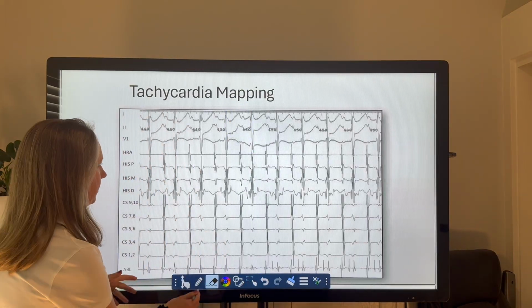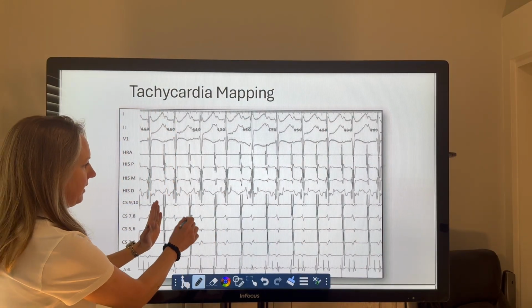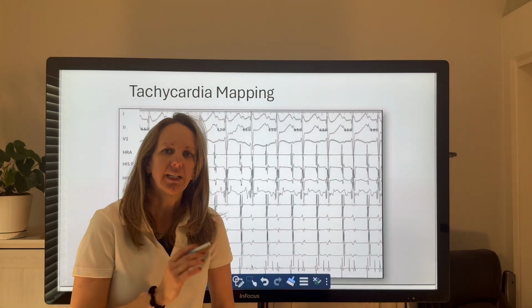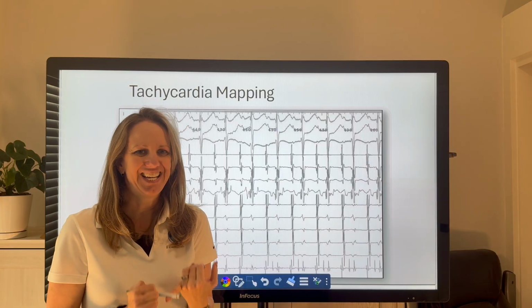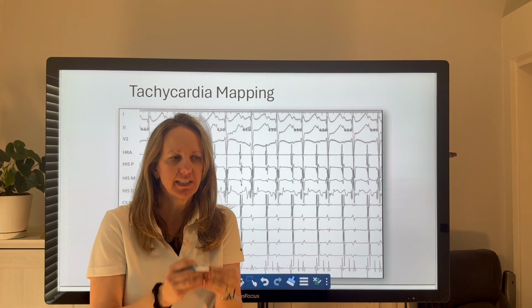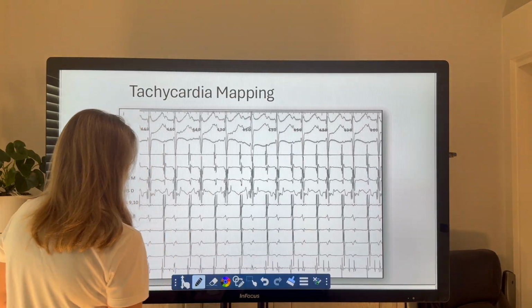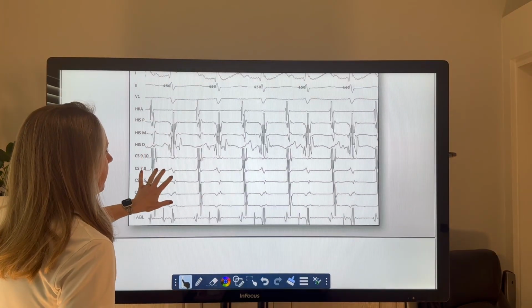Okay, so let's see. Took care of that noise, but now we are still in tachycardia. We are moving around the catheter to find the earliest atrial activation. With ATAC, you have to map in tachycardia, right? We actually have to find the earliest breakout spot, okay? It's not structural like AFib where we're just doing an anatomical ablation. All right, let's continue tachycardia mapping.